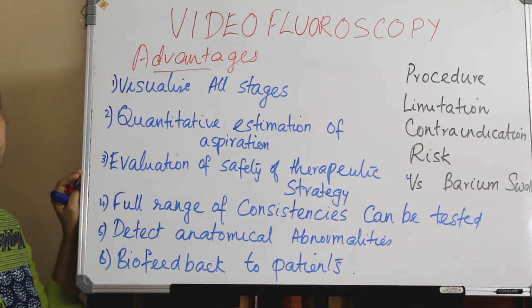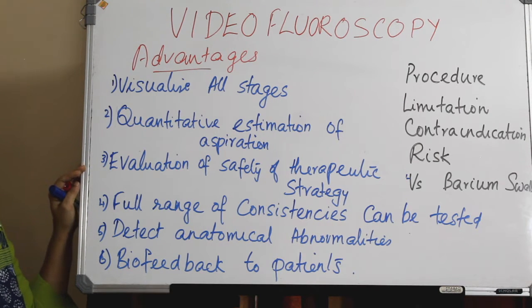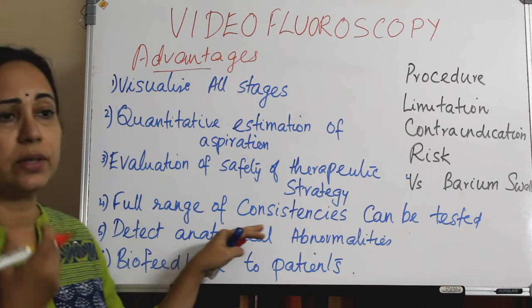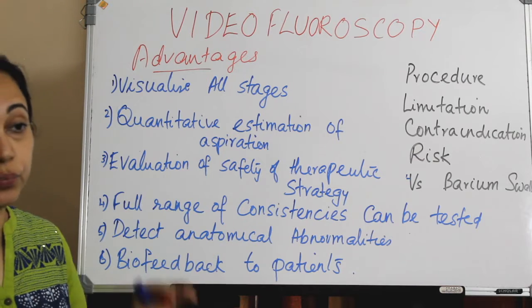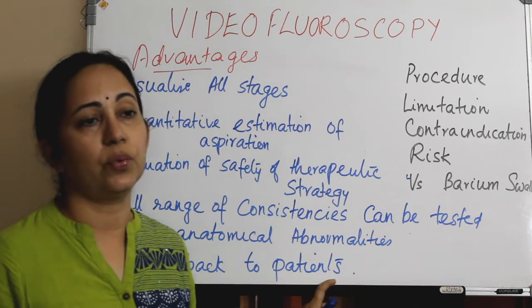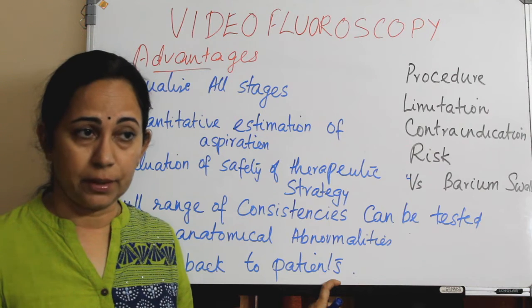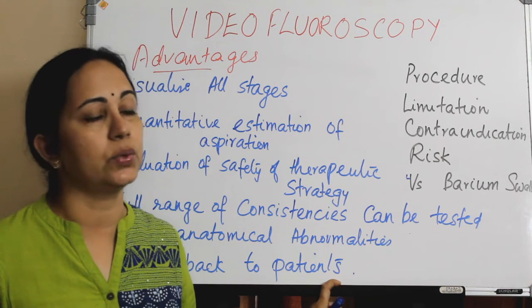Then the safety of therapeutic or rehabilitative strategies can be evaluated, and in regard to the food, the full range of consistencies can be tested by doing a videofluoroscopy. Also we can detect anatomical abnormalities, and it's an excellent tool for biofeedback to the patient, as the patient can see either a real-time basis or the recorded videos.